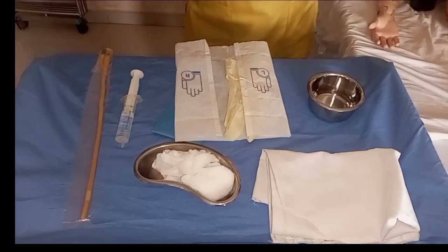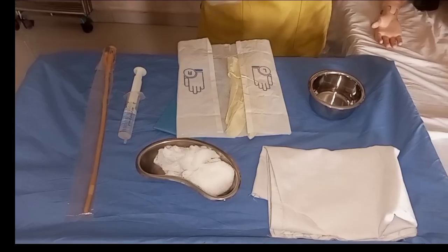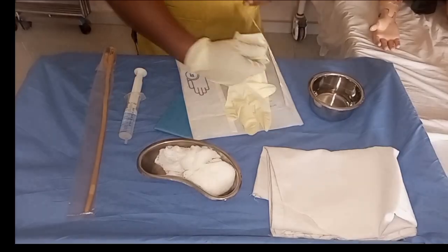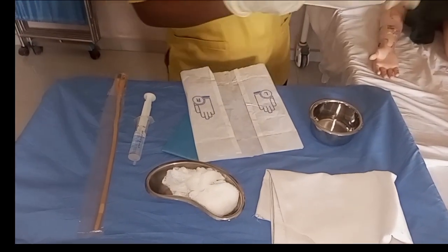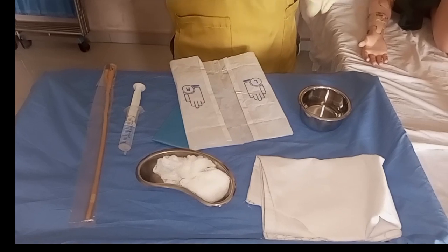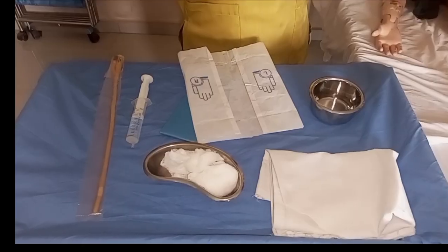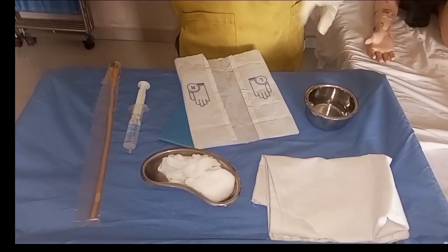Remember, during your OSCE you are expected to set your requirements. These are my requirements for this procedure. Be careful so that you do not contaminate the glove when putting it on.